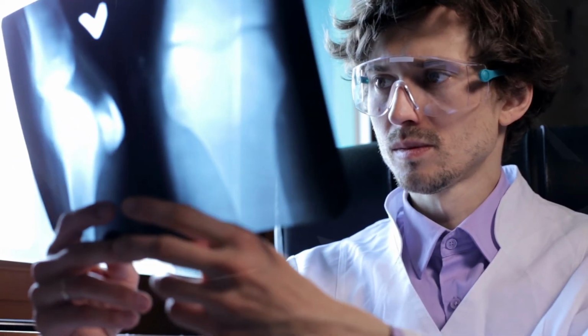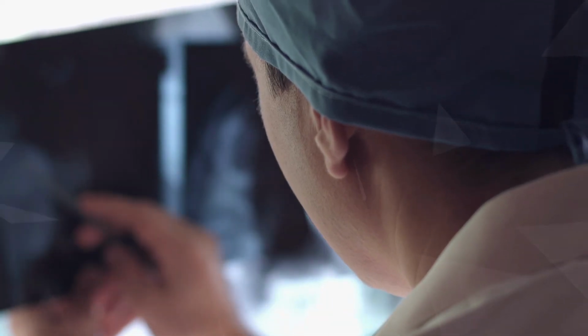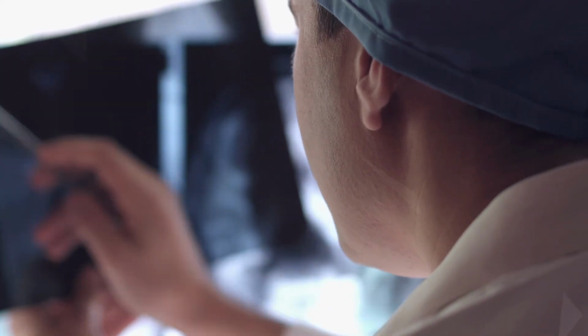And then when we're looking at imaging, we'll quite often take the components to a cadaveric lab and implant and take them to hospital scanners and look at the full gamut of potential modalities, so MRI, CT, X-ray, and we're looking for both can the component be seen, but also what can we see around the component, so that the typical structures of the anatomy.